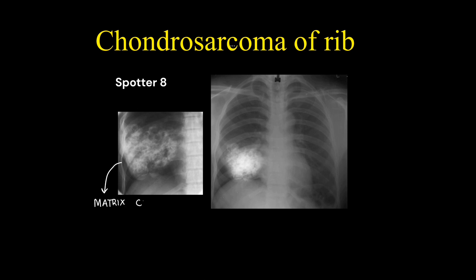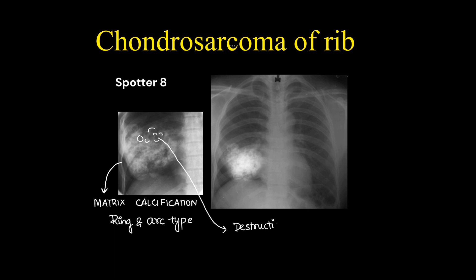This is a case of chondrosarcoma of the rib, where there is matrix calcification classically seen as ring and arc type. There is destruction of the affected rib because of a permeative pattern of growth.